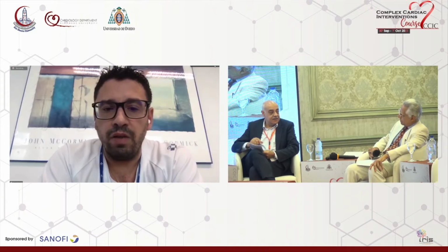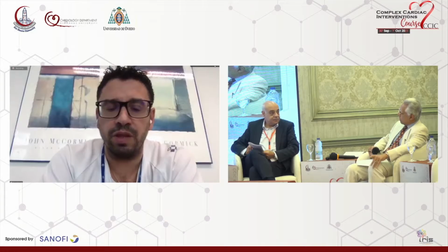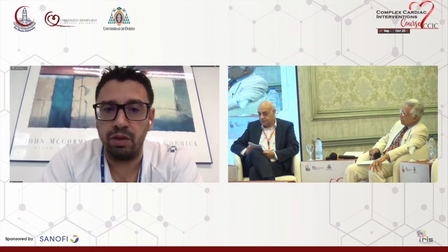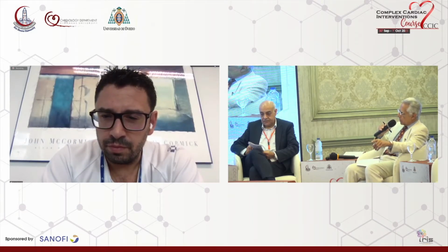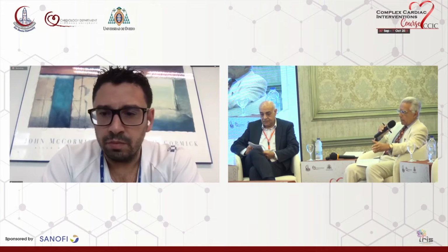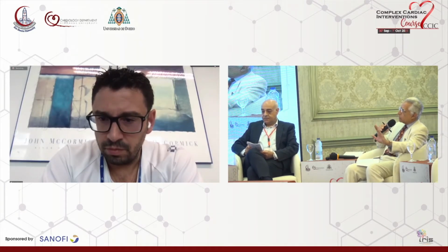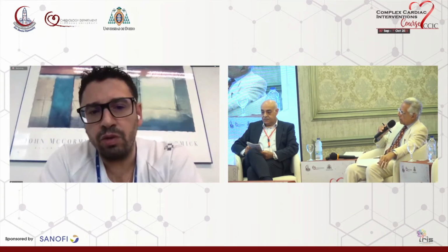Anyhow, if you don't have the conviction that your procedure is going to be useful, I think it's better not to do it. I'm not speaking specifically about this patient. This patient looks to have ischemia and he has an ejection fraction of 40 in spite of not having had a myocardial infarction. I'm speaking in general, especially if the patient has had a myocardial infarction before, whether you do this physiological test or not. Yeah, we usually do it.